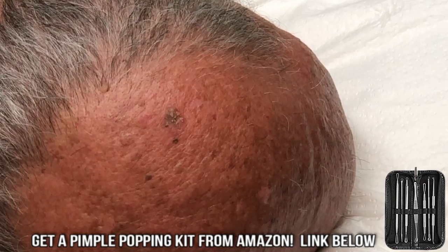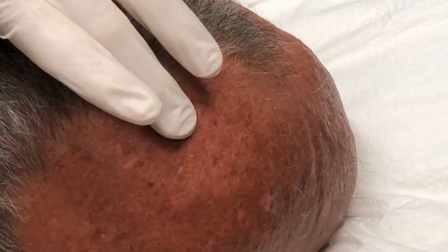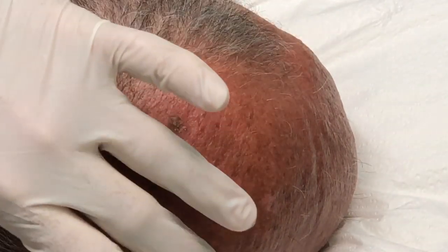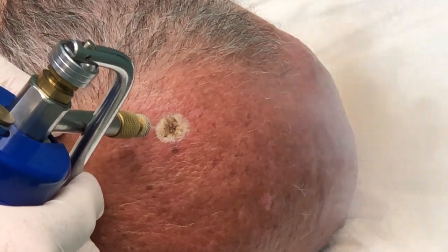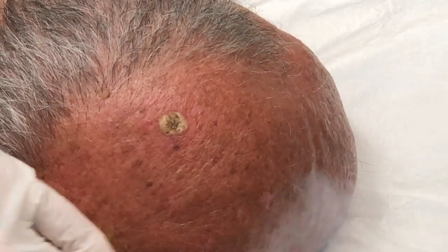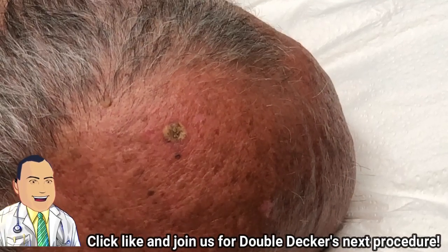So you take a couple of medicines, one for the prostate, and a blood pressure medicine, right? Yes, that's right. What I'm doing, the reason I'm feeling this, is I want to make sure that these have warmed back up. That's why I keep touching. In case anybody watching wonders, you want to make sure the lesion has thawed before you freeze it again, or it doesn't really work. There you go. All right, we're going to stop here. Then we're going to get you ready to take care of that other little one on your back.